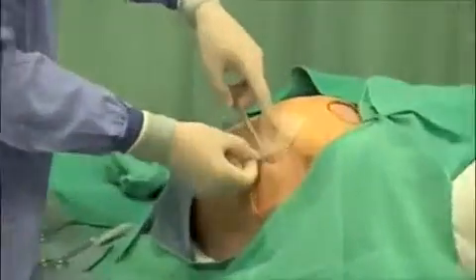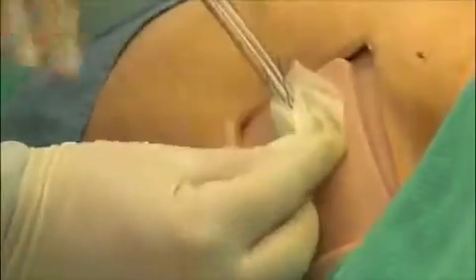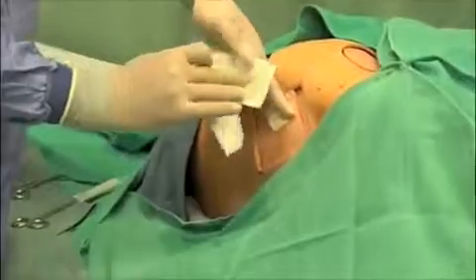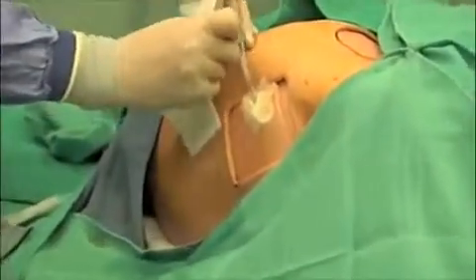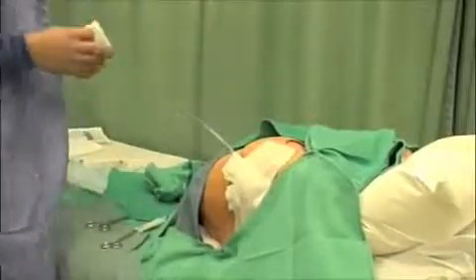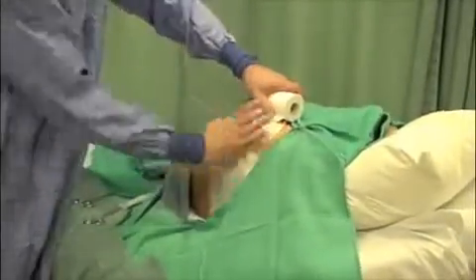Apply an occlusive dressing such as adaptic and drain sponges. Secure with Mefix. Tape the tube to the chest. A FlexiTrack may be used.